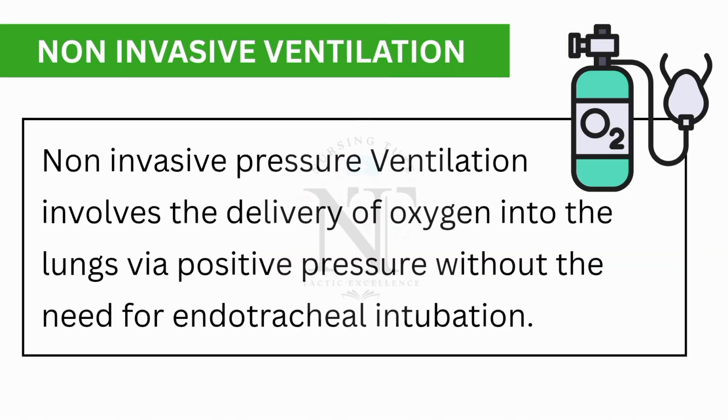As the name says, it is non-invasive ventilation. That means you are not going inside the trachea. You are giving oxygen via mask without the need for endotracheal intubation. Usually, patients on non-invasive ventilation are awake and alert, and they are breathing spontaneously on their own.